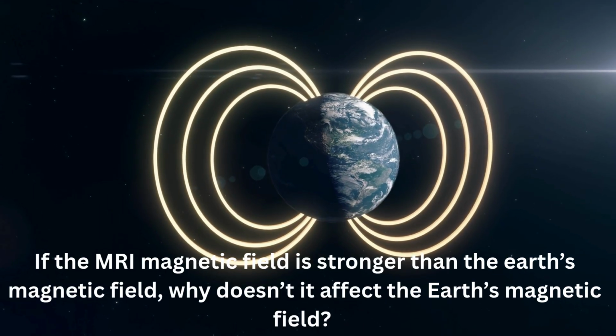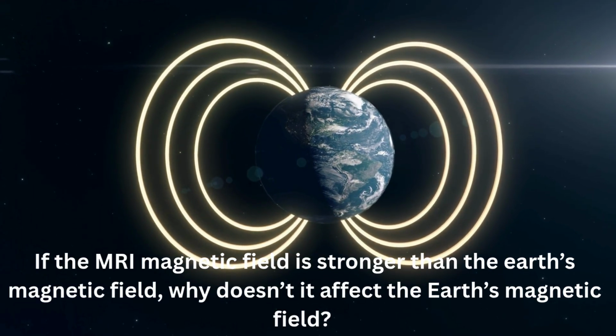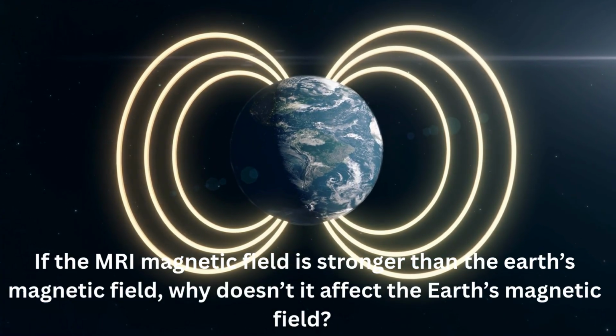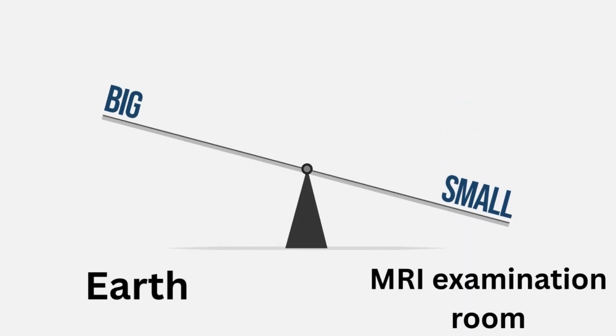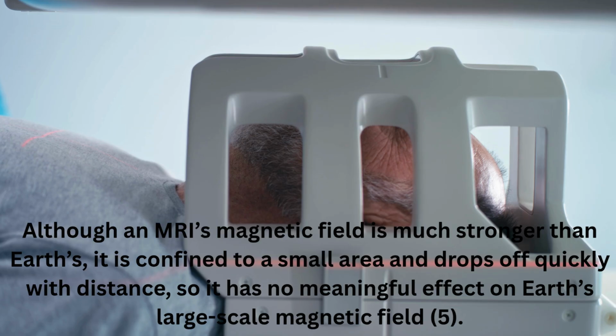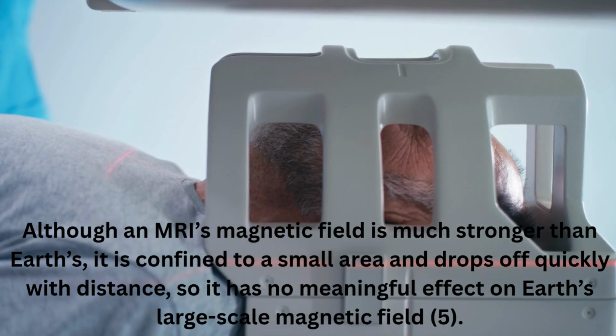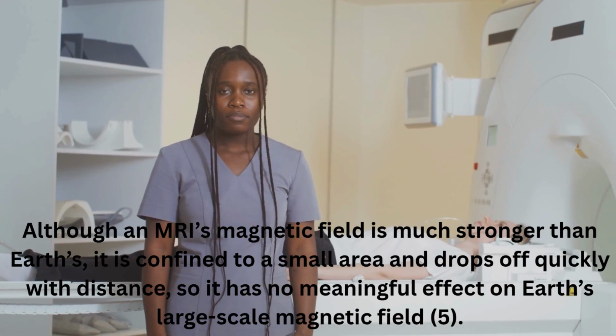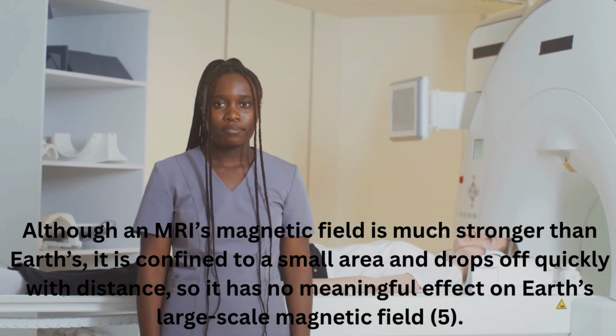But wait, if the MRI magnetic field is stronger than the Earth's magnetic field, why doesn't it affect the Earth's magnetic field? Actually, this has a very simple answer. Although an MRI's magnetic field is much stronger than Earth's, it is confined to a small area and drops off quickly with distance, so it has no meaningful effect on Earth's large-scale magnetic field.